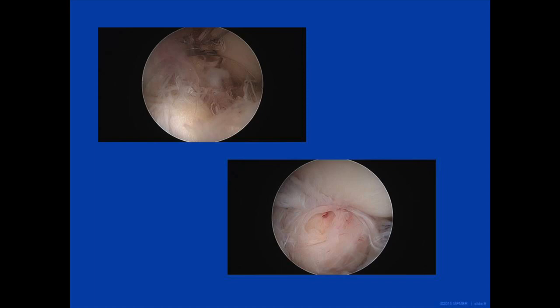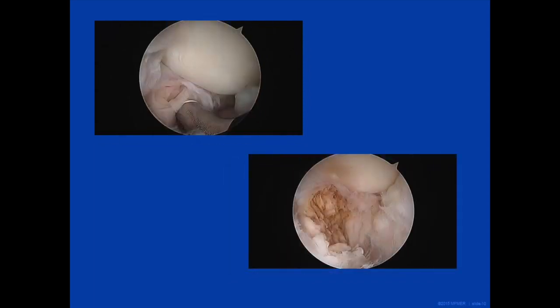In our case, we performed a biopsy and resection of the soft tissue mass in the posterior knee as noted in the figure on the bottom. The two posterior medial portals allow for visualization and usage of the werewolf coblation wand to adequately resect the mass as seen above. These portals help provide direct line of sight to the mass and a more complete resection.